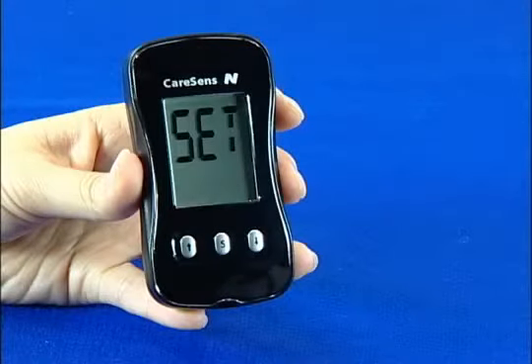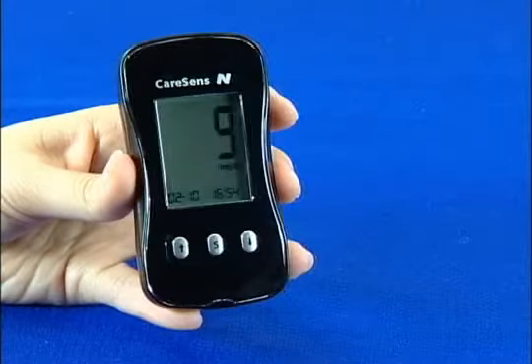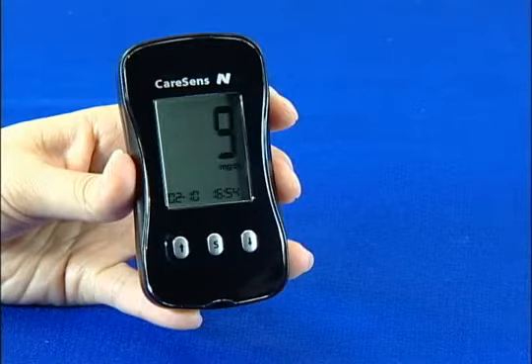The set mode lets you set or change the date and time, measurement unit, and beep sound on-off function. Stored test values can also be erased.